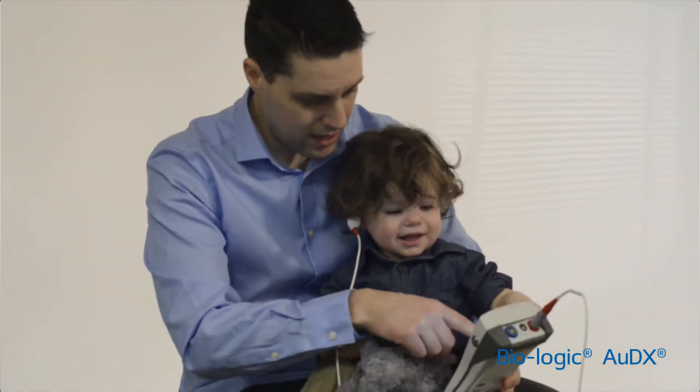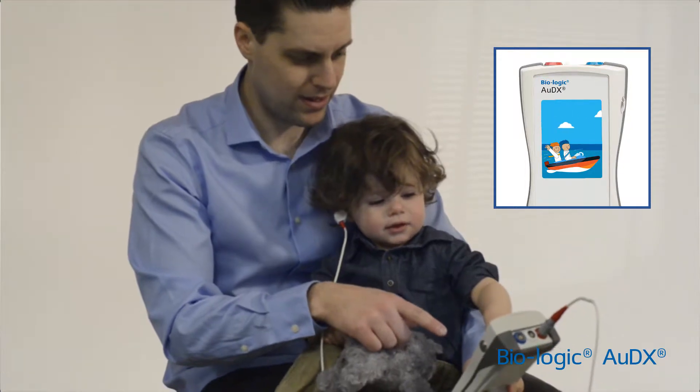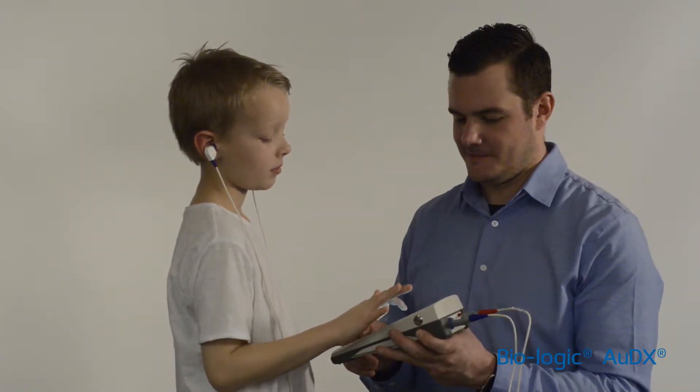A single-touch child mode features an entertaining animation to keep the child engaged and quiet throughout testing. Simultaneous multi-frequency OAE tests two frequencies at the same time and provides a fast result. The optional second probe allows for OAE testing of both ears at the same time.